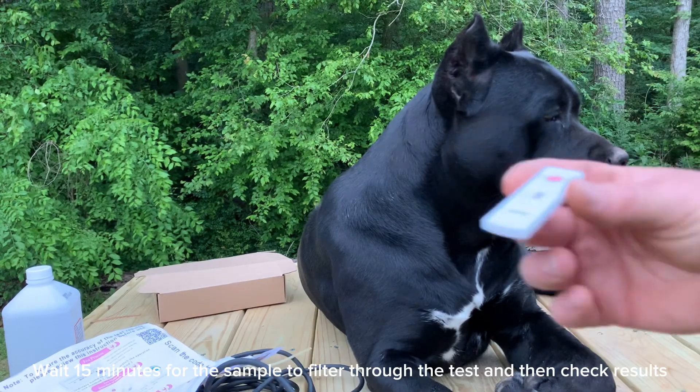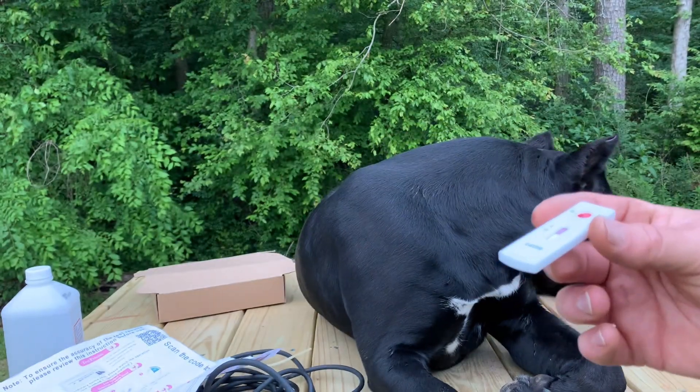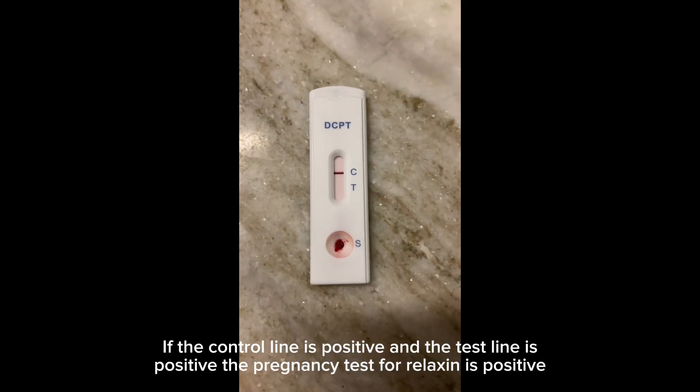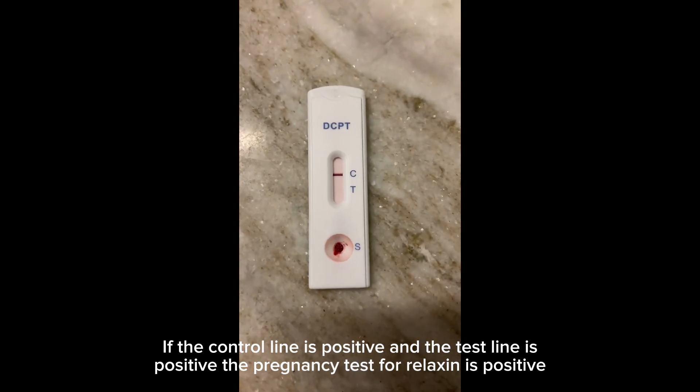Wait 15 minutes for the sample to filter through the test and then check results. If the control line is positive and the test line is positive, the pregnancy test for relaxin is positive.